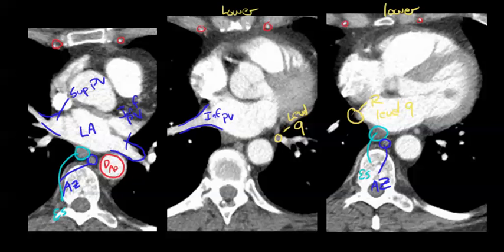The phrenic nerve runs pretty close to the veins on the right side — up here it's going to be on the SVC, then it lays within about a centimeter or so of the veins. On the left side, the phrenic nerve stays further out in front, somewhere in here — so this will be your left phrenic nerve and this is your right phrenic nerve. That's the anatomy of the mediastinum along with the nodal stations.